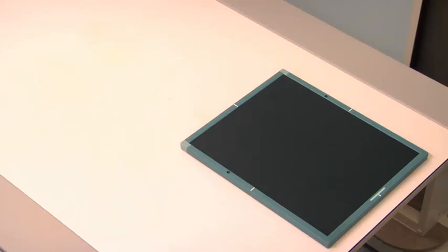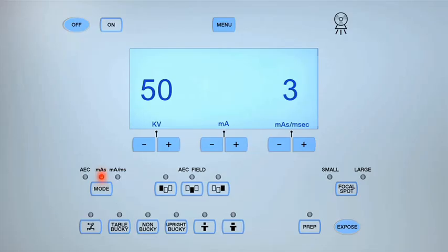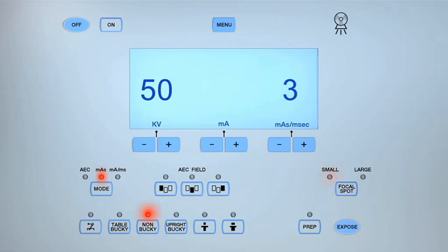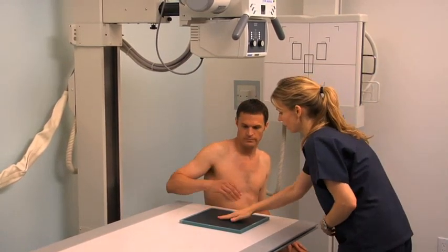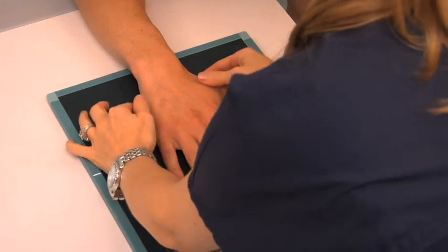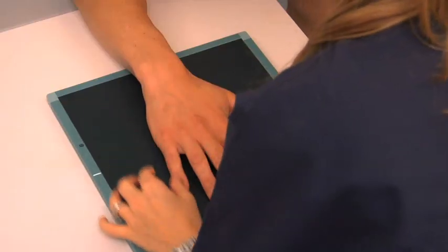To obtain a radiograph of the hand in the PA projection, begin by placing a 10-by-12-inch cassette on the end of the radiographic table. Set the SID to 40 inches and align the central ray to the middle of the cassette. Select the non-bucky setting and the small focal spot. Set the exposure parameters to between 50 and 55 kilovolts and between 3 and 4 milliampere seconds. Ask the patient to sit alongside the end of the table, position the lead shield over their reproductive organs, bend their elbow to a 90-degree angle, and place their hand palm down on the cassette. Align their hand with the center of the cassette and separate the fingers.